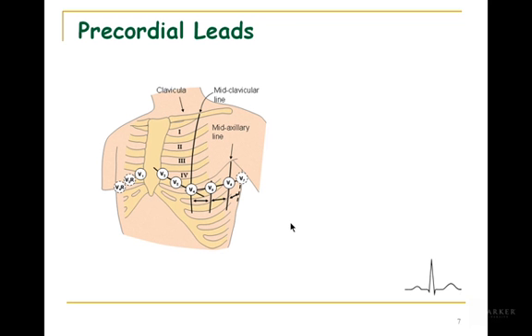They are unipolar, in that what the machine does is you've got electrodes placed on the chest wall, but you still have those leads placed on the right wrist, the left wrist, and the left ankle. So the machine somehow combines the right and left wrists and that left ankle, combines those leads together, creates this null potential, they call it, this negative potential, right there at the center of the heart, and these leads are the exploring leads.